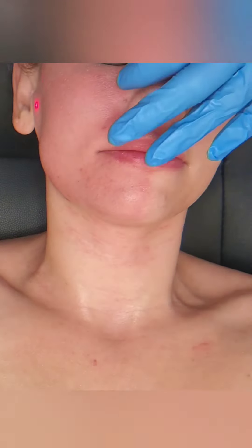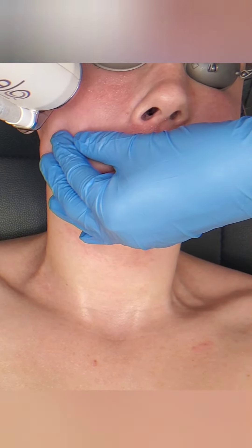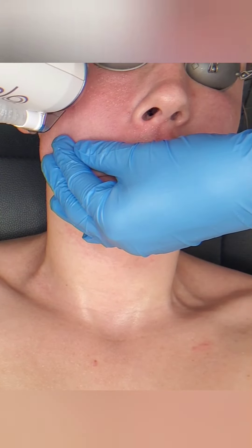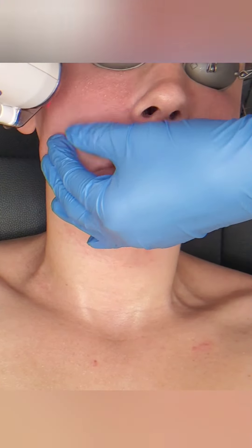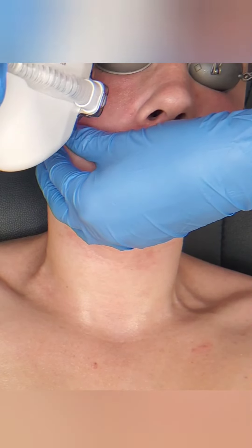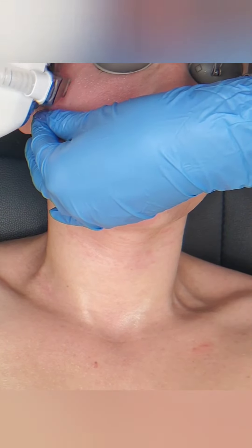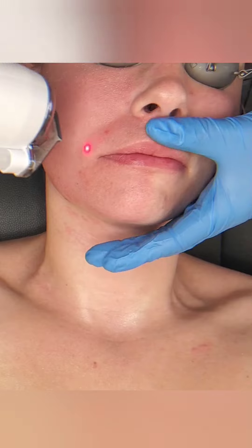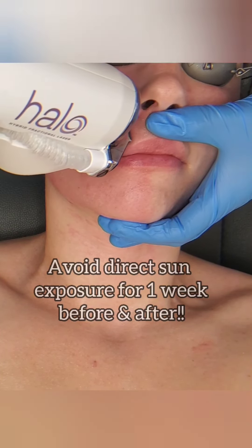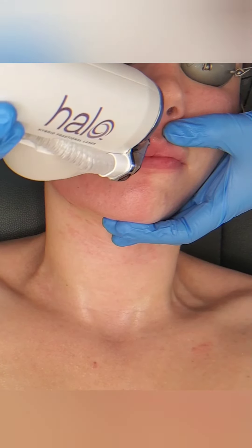That's why you have to have a consultation before we schedule this — there's too many things to go over to try to discuss it and then treat on the same day. For one, you may not be a candidate. You may have some contraindications — that doesn't mean we can never treat you; it's just that maybe you've had too much sun exposure or have an event coming up where you weren't aware of this much downtime. It's best to do a consultation, as it's a requirement because there's so much to consider.